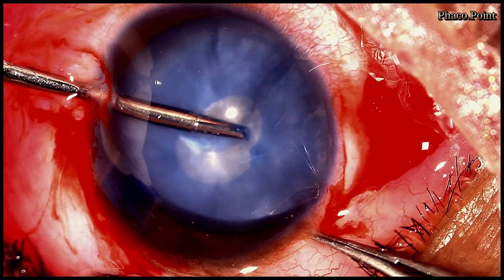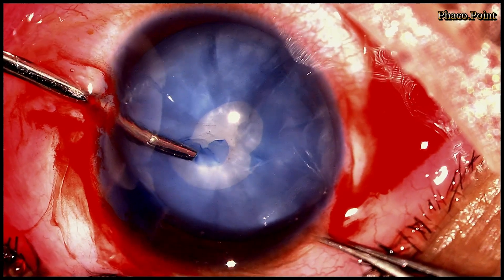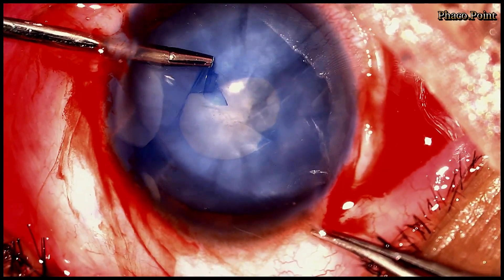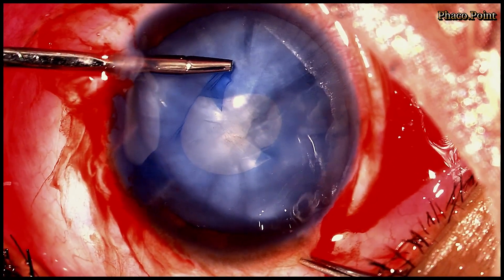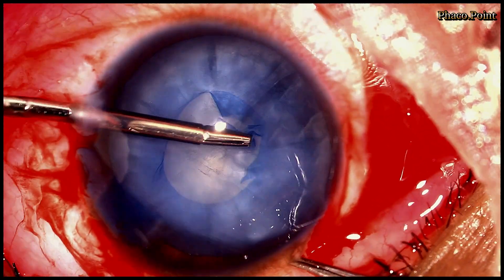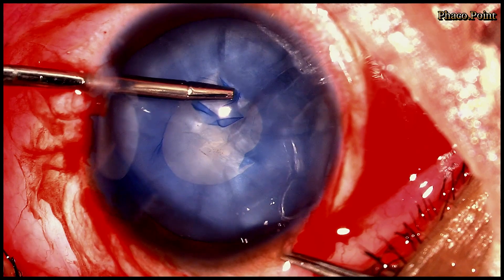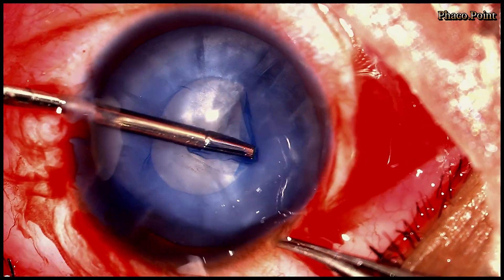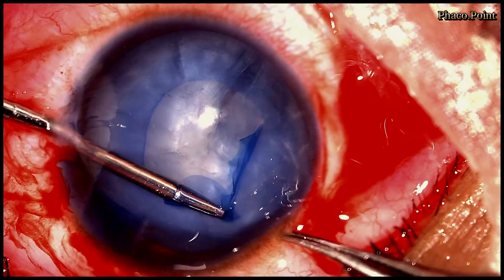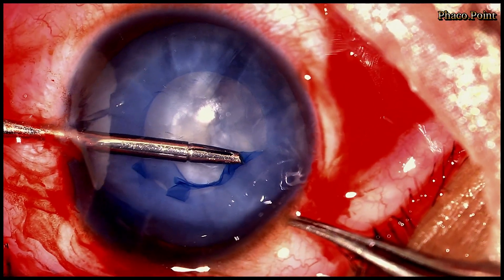I re-grasp, release, and re-hold, propagating the tear suitably to get the opening of the size I want. I always like to do it under a dispersive viscoelastic and with the help of a micro rhexis forceps introduced through the side-port incision, so as to not lose any anterior chamber — which would be a distinct possibility if I were to use a utrata through the main incision.